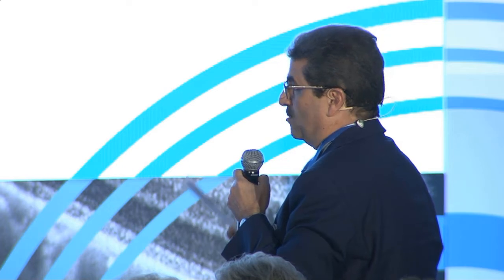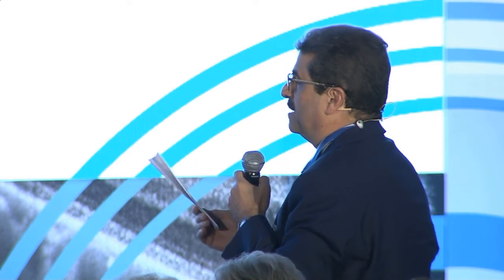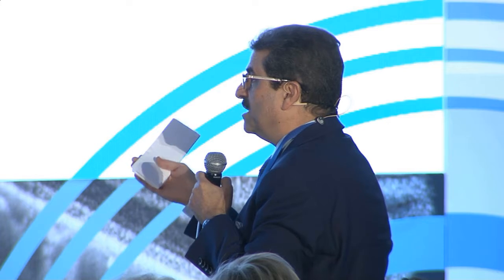I see. Magdi? My question to Dr. Martin about the PCV. You said that OCT-A is not yet reliable on detecting PCV. That's right. In your research, how often couldn't you find the polyp by OCT-A? In our country, for instance, we don't have ICG. We are out of ICG. We don't do ICG anymore. So how much can we count on if we rely only on OCT-A?